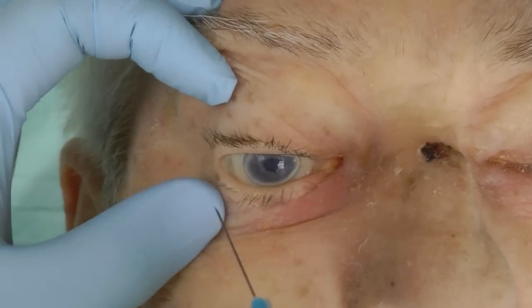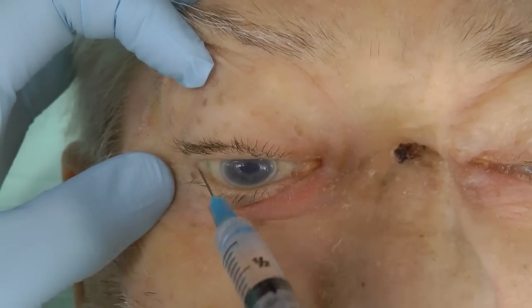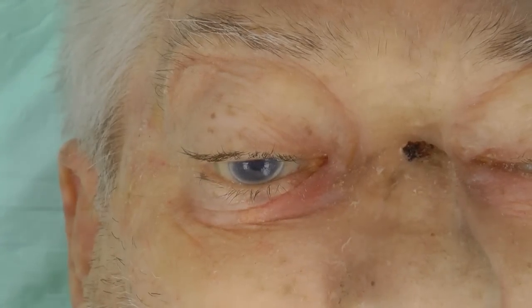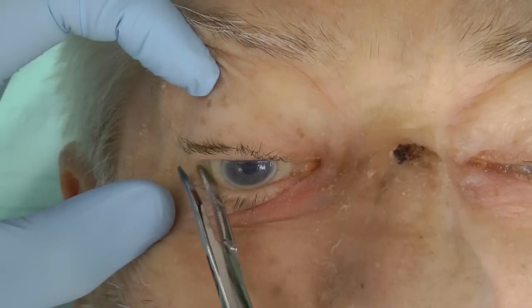Lateral canthotomy. The lateral canthus is anesthetized with caution to avoid puncturing the globe. The lateral canthus is then crushed for one minute with a clamp to reduce bleeding when it is incised.